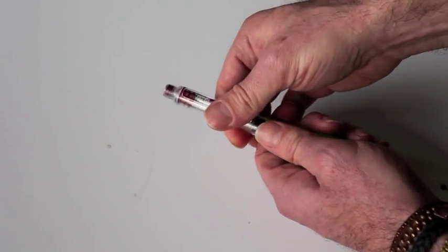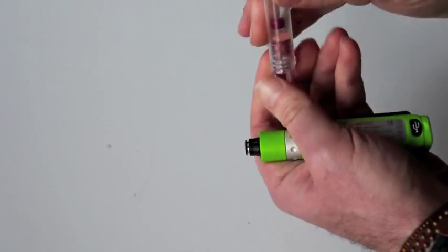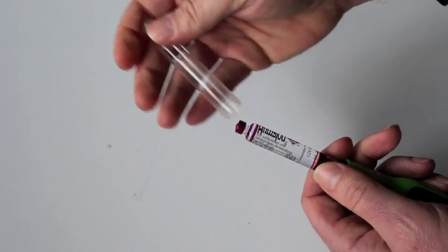So the next thing we do is we're going to take out the old cartridge. We just unscrew that. There we go — so I have an empty cartridge. Now we put in a new cartridge, put that in here.